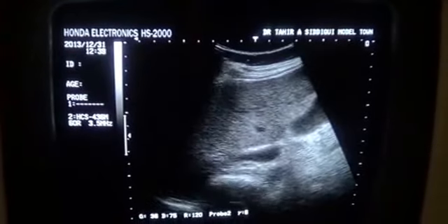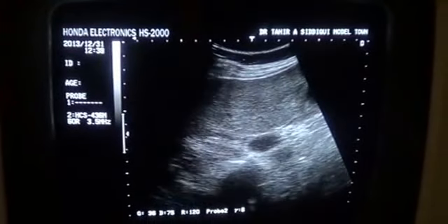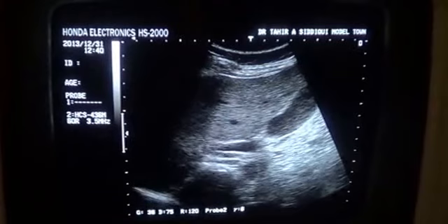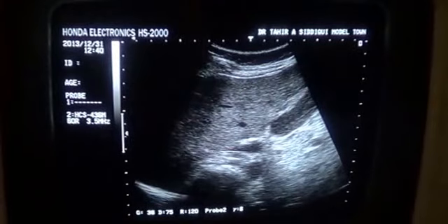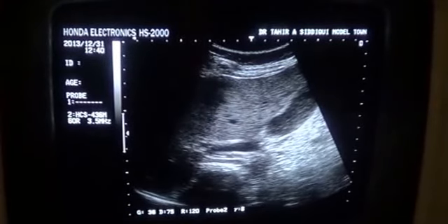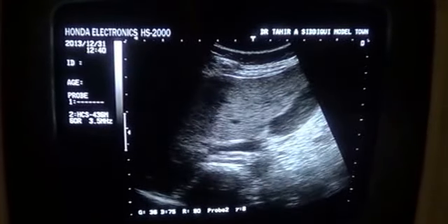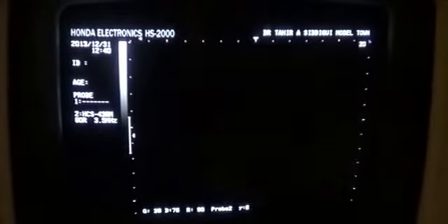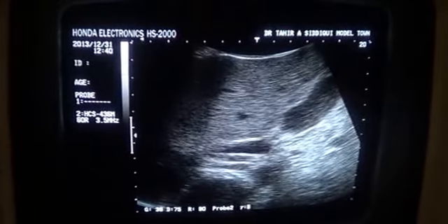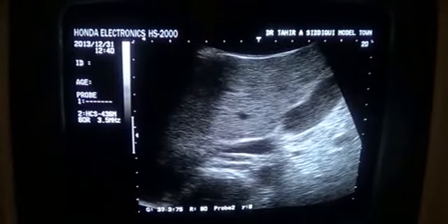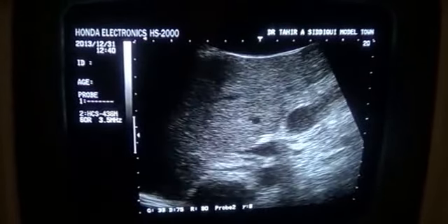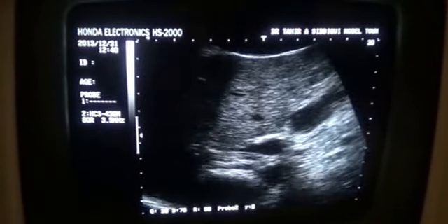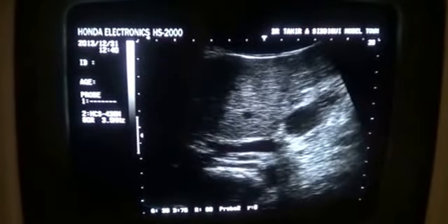Now you can see the position in which I see the longitudinal section of the right renal artery. You can also see the pulsations in the right renal artery — this is a magnified view.